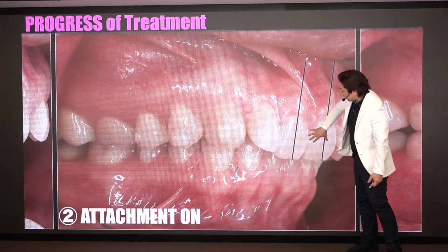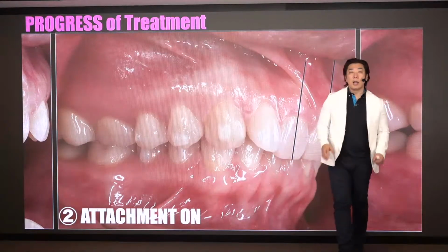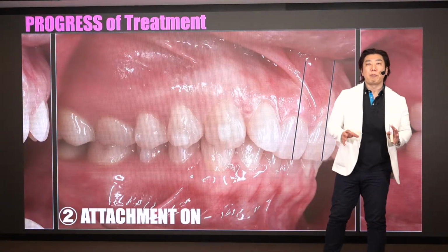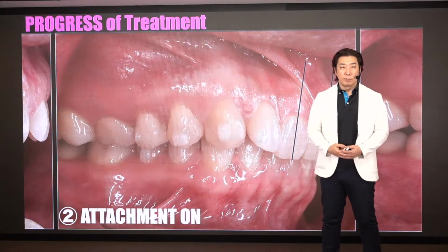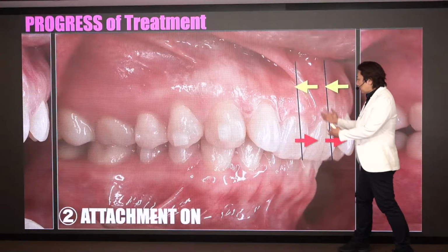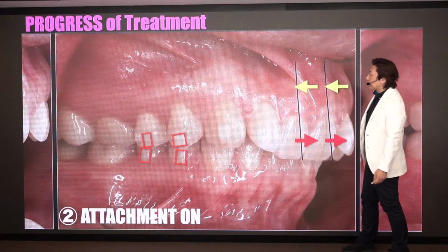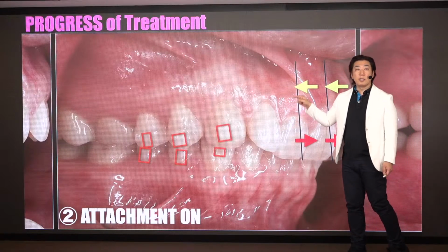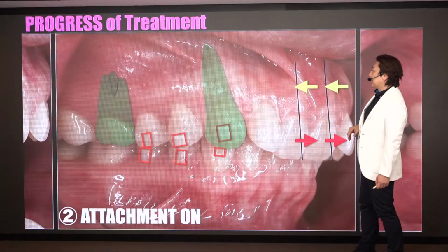Control the upper anterior teeth axis and place the attachment. Okay, the attachment procedure is a very, very important thing. Please watch our published book. Okay, then this is the same as this. Root control. The crown is proclined. Not molar distalization, only focus on the anterior teeth.